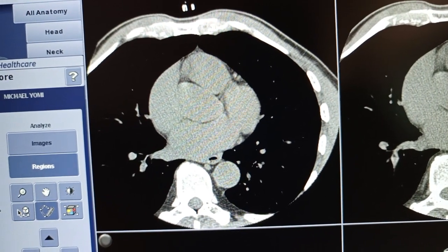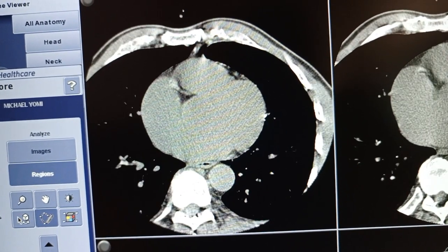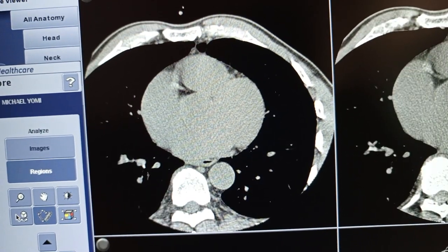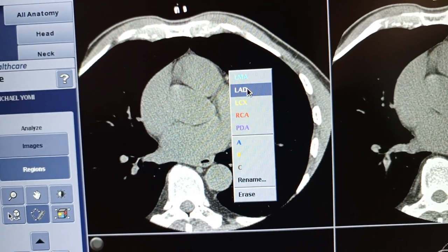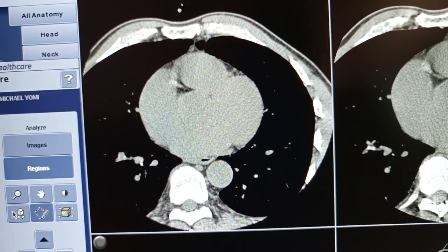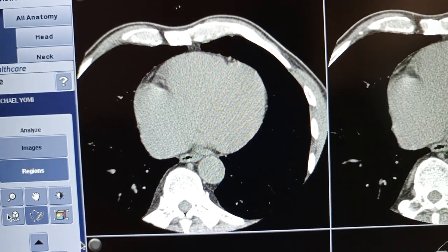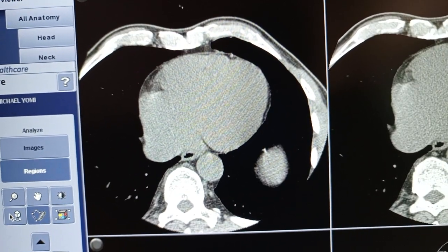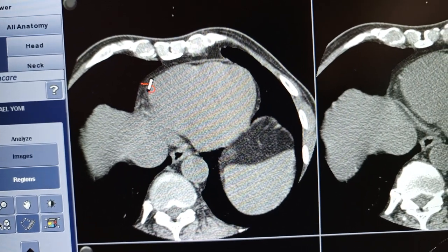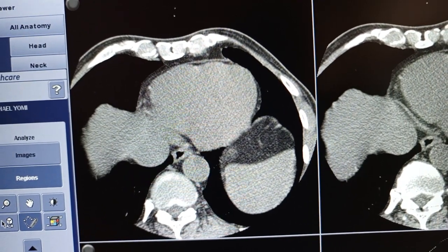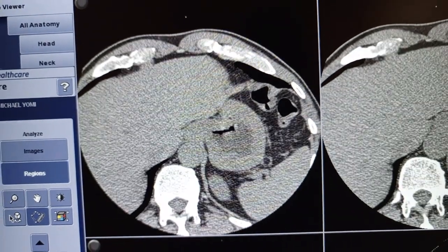Looking carefully — it doesn't catch anything here, so there's no plaque in there. Then we have the right coronary artery going that way and the left anterior descending going that way. When you identify the artery, you name it. Going back to confirm — no calcification is present. You go through all the arteries around the heart that are visible.